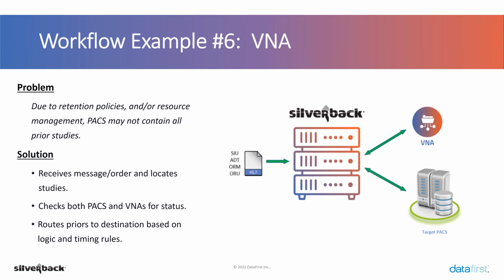Brian asked a question: is your product modular? Can I scale it by putting certain roles on dedicated VMs? As we speak today, no. It's not a modular solution in that way, where you can take a piece of the solution and put it on multiple VMs.